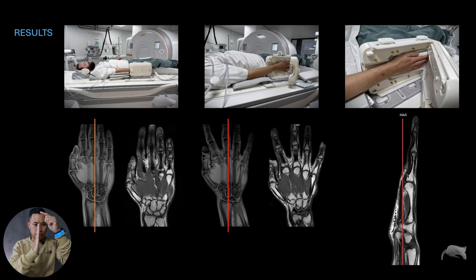The last issue is tilting. You can see I really want the fingers straight, but because of the pad placement, the hand is somehow tilting backwards. It is much better to place the hand into the coil to make a straight line first, and then fixate on the outer part of the hand.